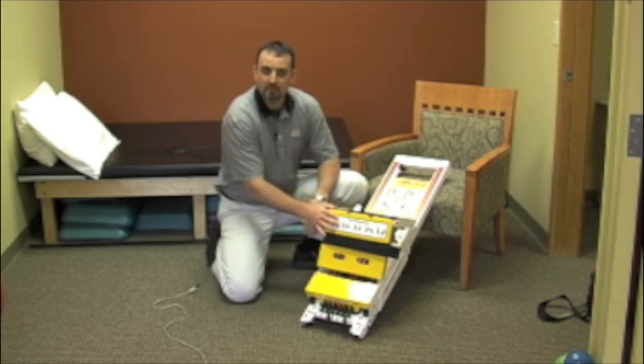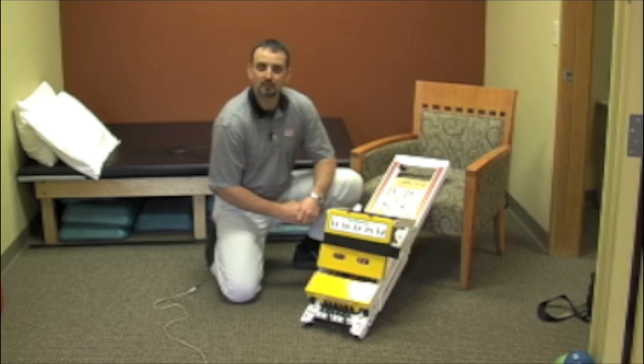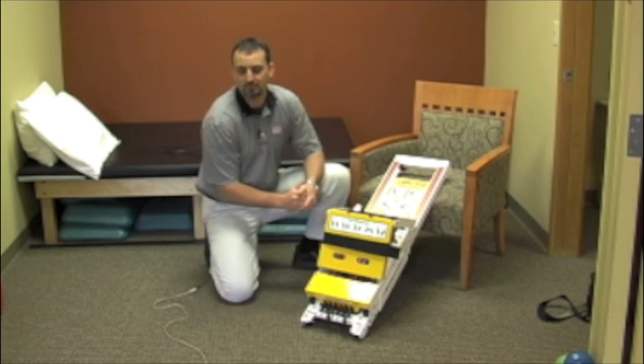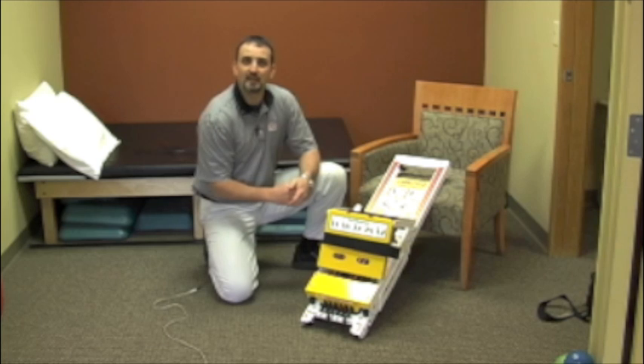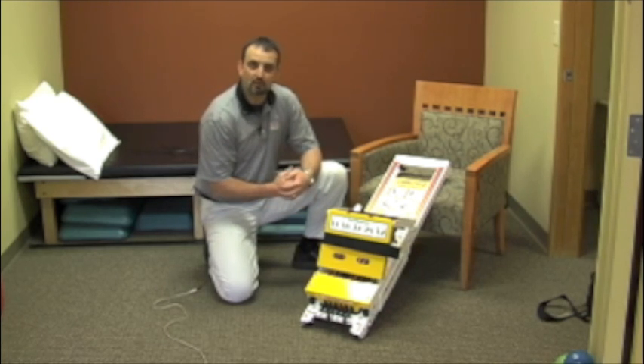The nice thing about this piece of equipment is its versatility. It can be used in the home for home health care — we can bring that Mini Press right to you at the home. It can be brought right to a client in a subacute rehab setting and used for upper and lower extremities.